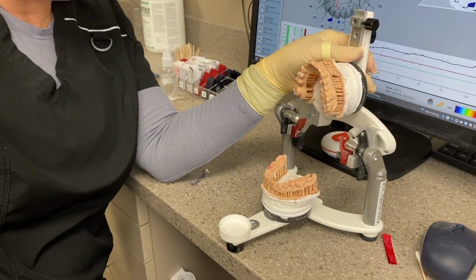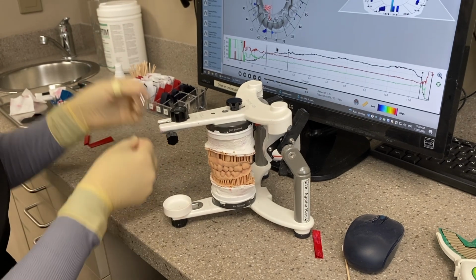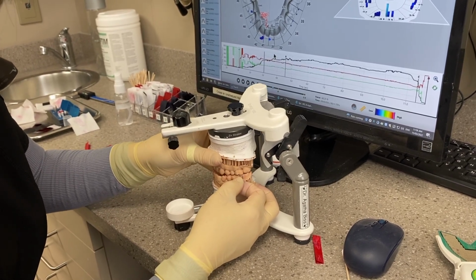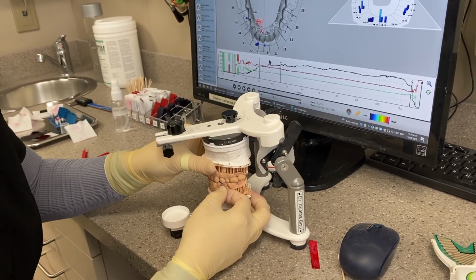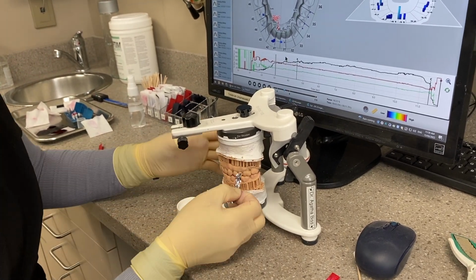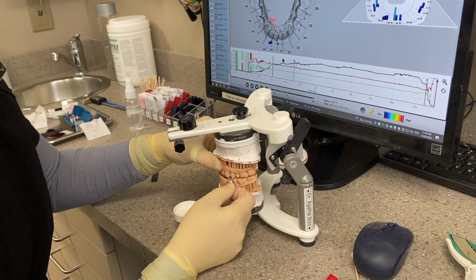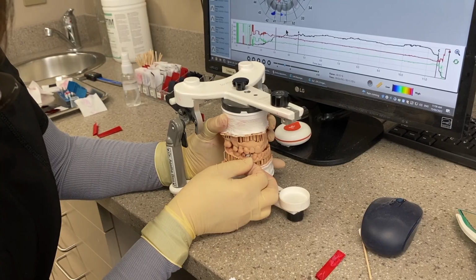7s are actually very, very common for us to see in terms of pain on slides, because a lot of people don't check for lateral slides and buccal cusp interferences. So that's a really common tooth pain issue. Really common bite adjustment here. And now I'm clearing up all of them. So all the adjustments so far, except for the one tooth that we're going to be doing porcelain only on, have been very conservative and minor. So there's no need to do any dental work on her on anything but that one tooth. Now it's front teeth.